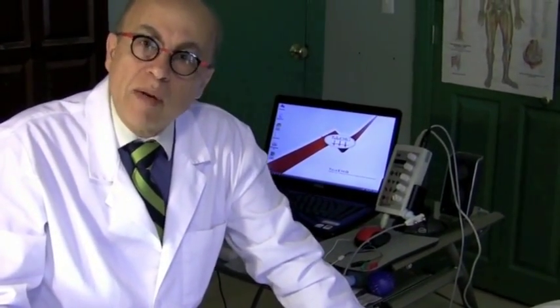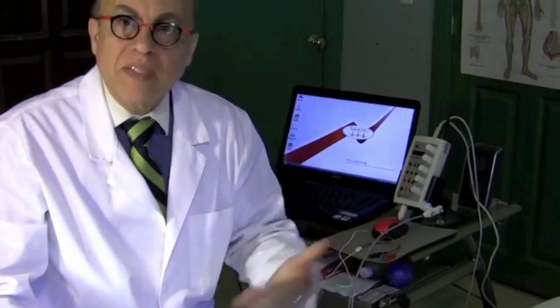Now, what are EMGs useful for? EMGs are useful for a lot of conditions and a variety of problems that affect the nervous system. The one that you've probably heard most about is carpal tunnel. A lot of people have carpal tunnel with hand numbness and tingling and sometimes weakness, patients with low back pain, patients with diabetes who get diabetic neuropathy. For all of these conditions and others like trauma and injury and neck pain, a lot of physicians order nerve conduction studies and EMG testing because they want to see if the nerve is impaired, is damaged, how bad, and where it is impaired.